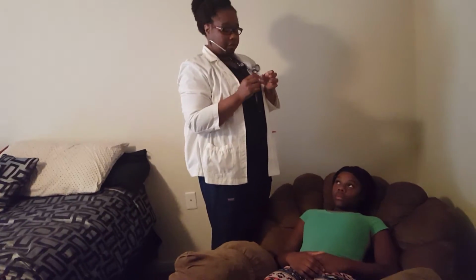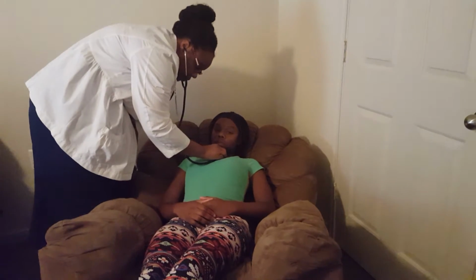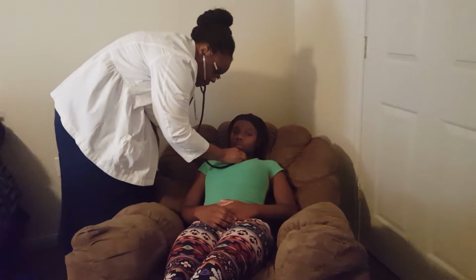Now I'm gonna listen for my heart murmurs, and I will use the bell and make sure I'm turning my opening to the right side. And I will just listen to each area there, listening for any murmurs or extra heart sounds.